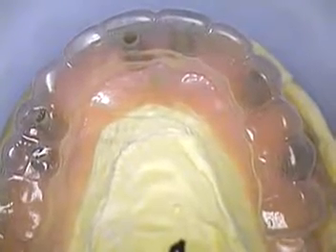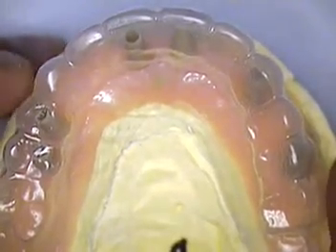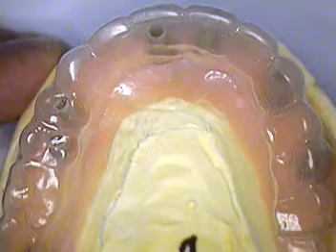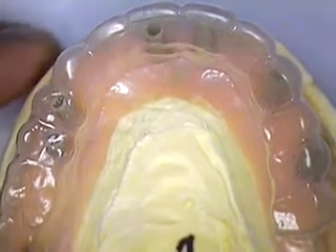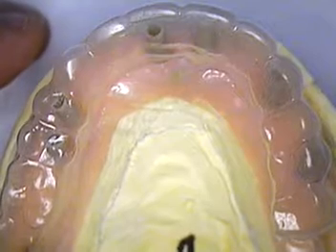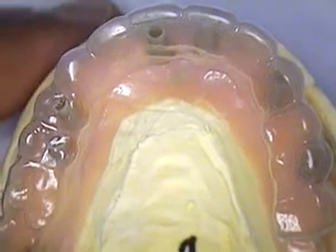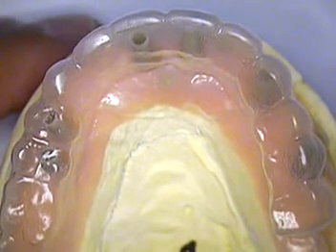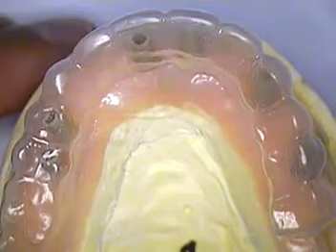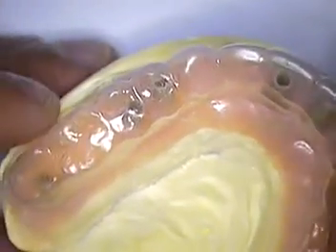We're getting ready to design the abutments, and I want to go through a sequence of steps that will help in the overall scanning and eventually CAD/CAM fabrication of the angled abutments, and then finally a framework which will be fabricated to those abutments, ultimately the finish of the case. So a little bit of lab work discussion again.